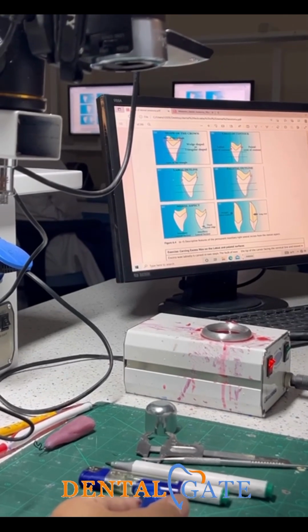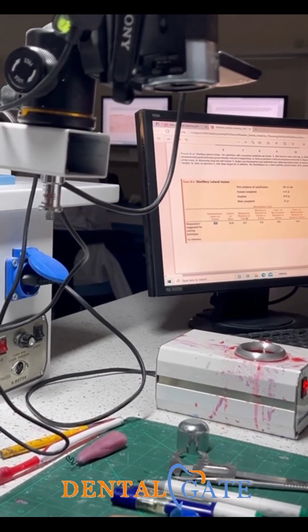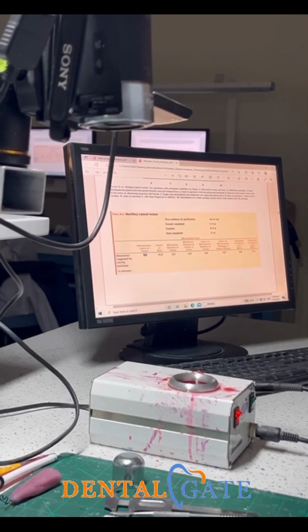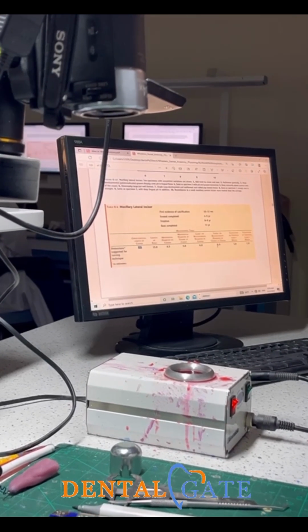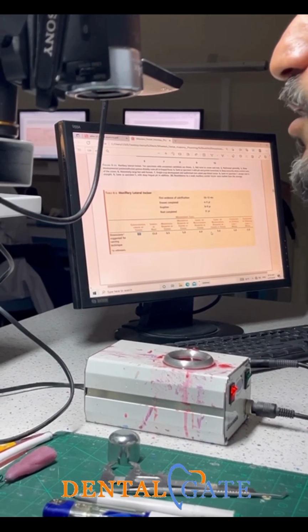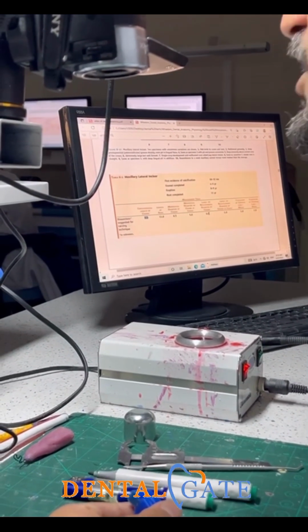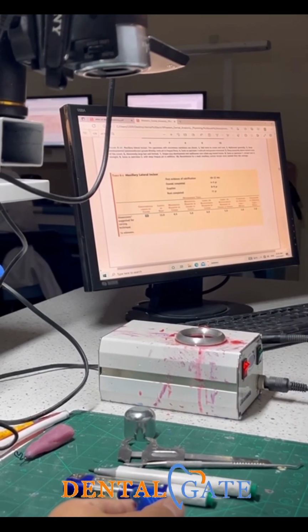Otherwise, I would use the labiolingual diameter of the crown and the labiolingual diameter of the other cervical. So there is no difference. You can assign only 5 or only 6, or you can assign both of them. Okay, there is no difference, but it will produce the edge at the cervical. It's for what? For a professional work. Okay, so I will assign it.